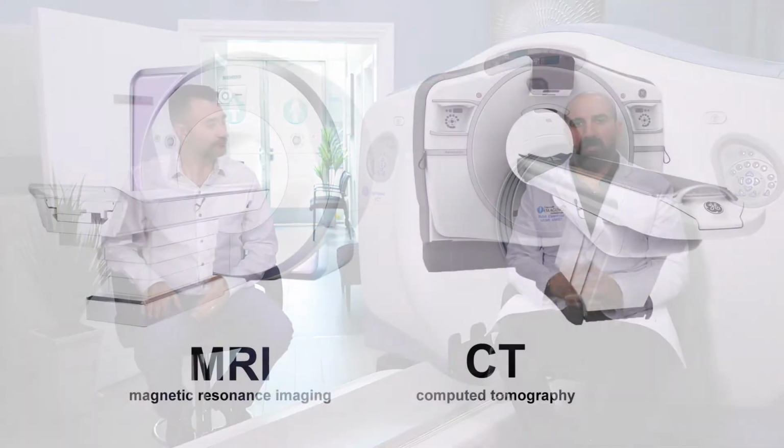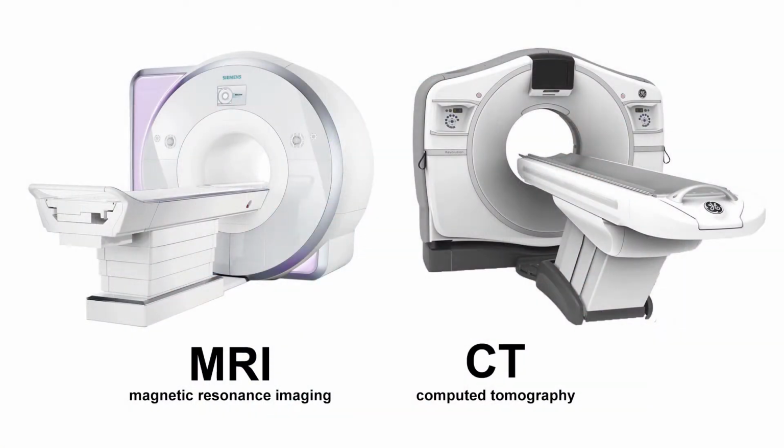We have a lot of cases where patients get confused, but once you tell them, they realize it's the exact same thing. It just makes perfect sense to them. As far as the main visual differences, as you can see on your screens, MRI looks like a tunnel with a smaller, narrower opening, versus the CAT scan, which is right behind us, which has a larger opening and is donut shaped.